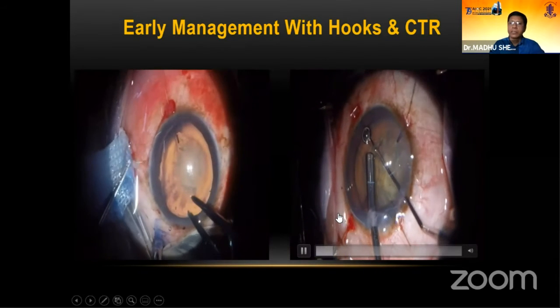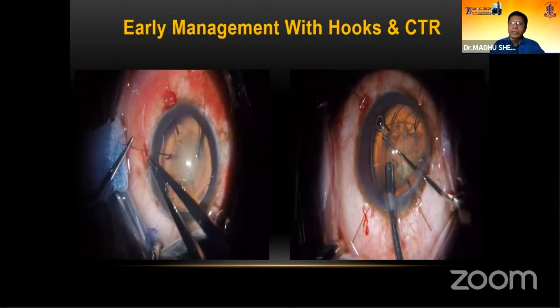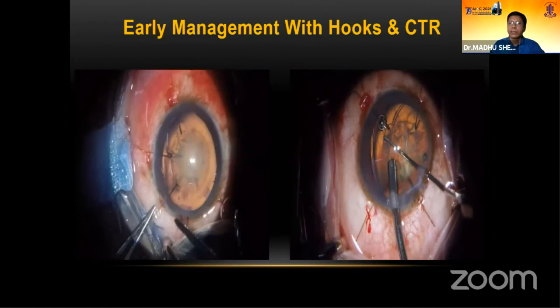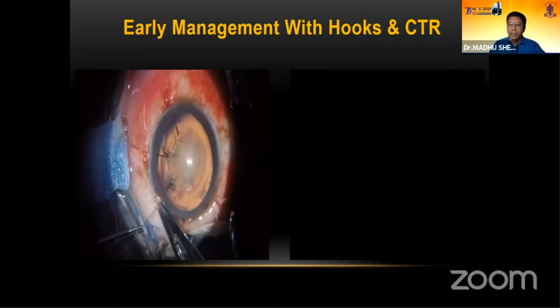Sometimes you can use a CTR preoperatively also, so that it will further stabilize your bag and prevent further vitreous prolapse. And sometimes during phaco, due to surge, there will be chances of rupture of the capsule. So it will protect you at that time.